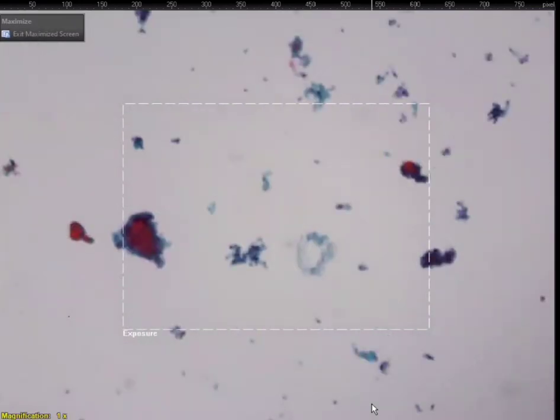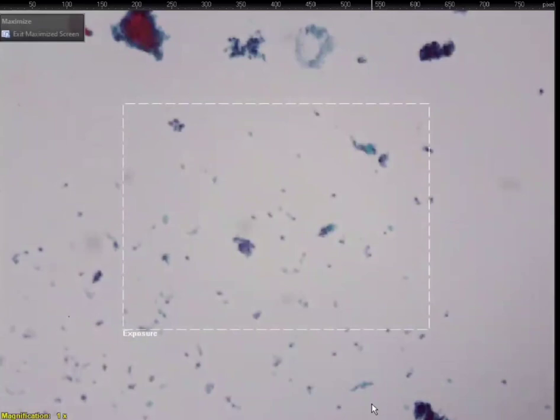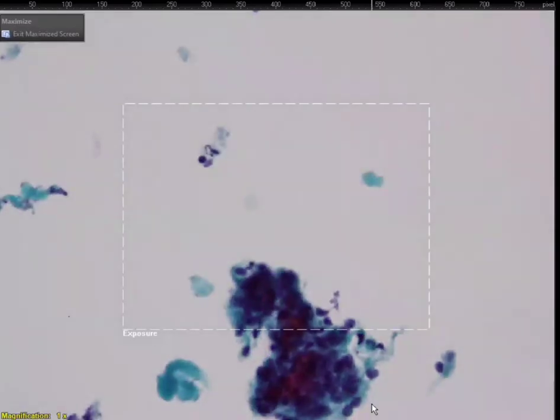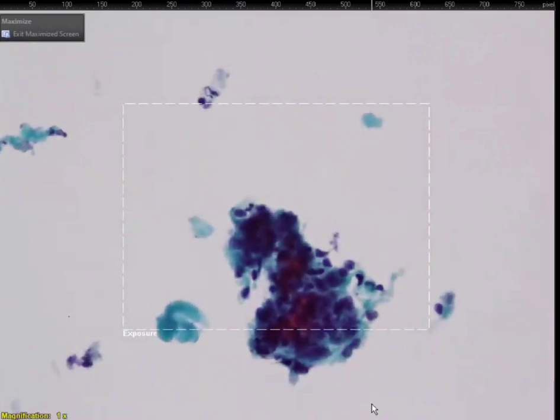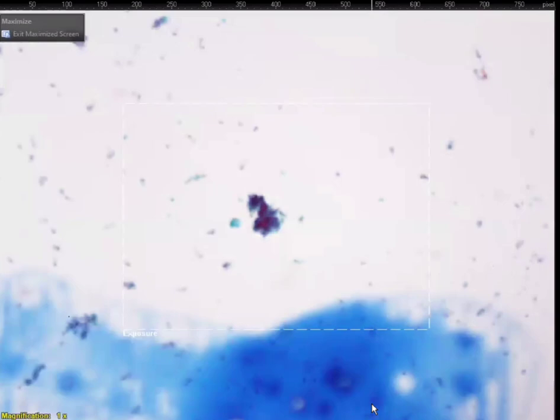Squamous cell carcinoma or epidermoid cyst, or what? Then you worry about mucoepidermoid. Yes, mucoepidermoid is a top differential. Does mucoepidermoid have a bit of a cystic background? Yes, mucinous and cystic, and then you get some squamoid kind of cells, and you also see multiphasic cells, clear cells, basaloid cells, squamoid cells, a mixture.